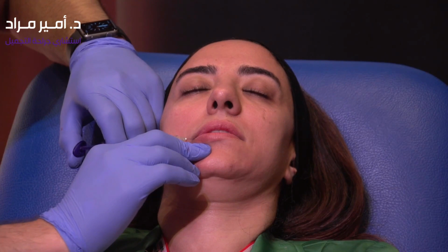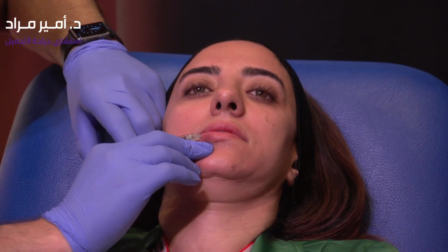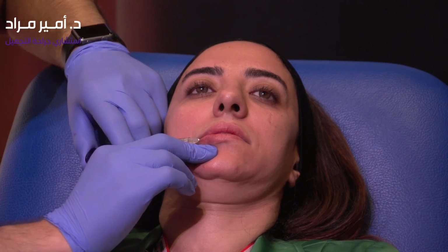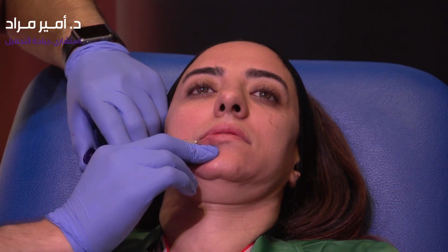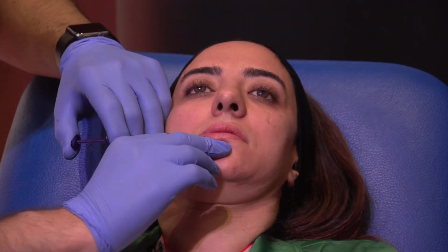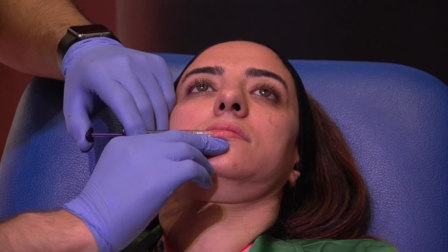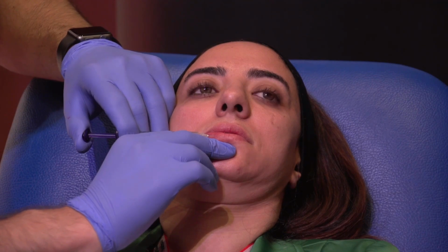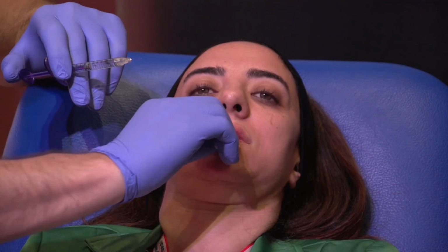The lower lip is less painful. Okay. Aspirate and then inject as you are coming out. Very simple technique. I know there are many techniques out there for the lip, but this I think is good for augmenting the lip in total. So I'm augmenting every structure as much as it needs. I'm not putting products in a special area or subunit more than other areas, because I've agreed with the patient that she has beautiful lips to start with, so just augment everything.